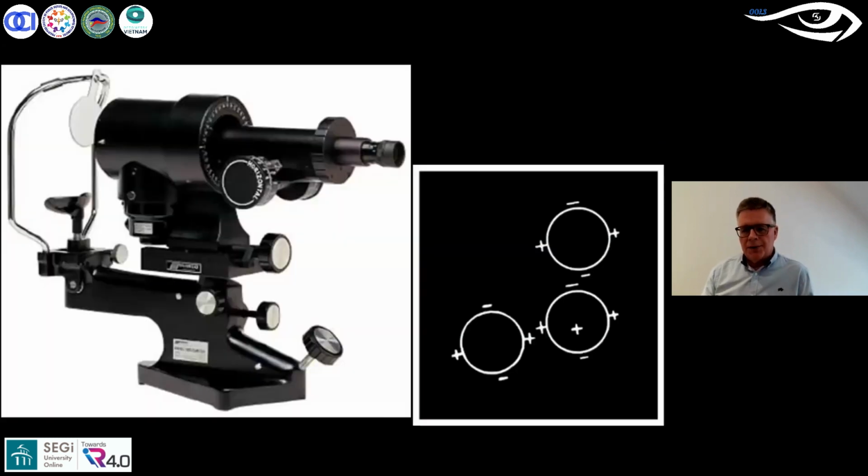And what happened was that the keratometer sort of fell into place. It was never really designed for contact lenses, but it was swallowed up by contact lens fitters, contact lens opticians, ophthalmologists who were fitting contact lenses. And of course, what we have is this rather ugly Victorian instrument, which gave us fairly simple imagery. I call these spaceships. I think they look like something coming in from outer space, but they give us a reading of the central part of the cornea.